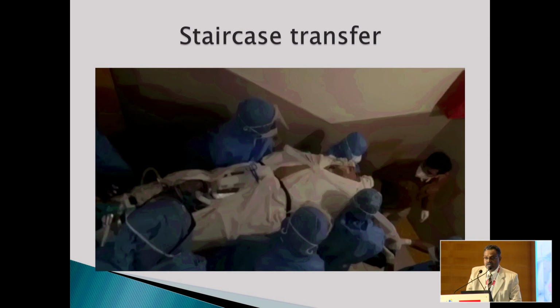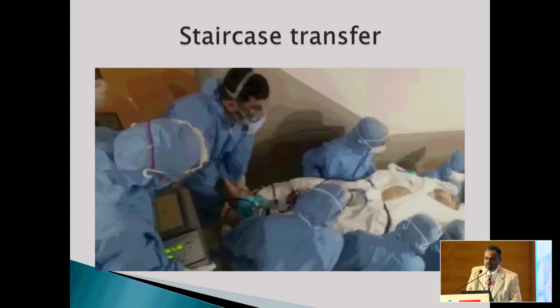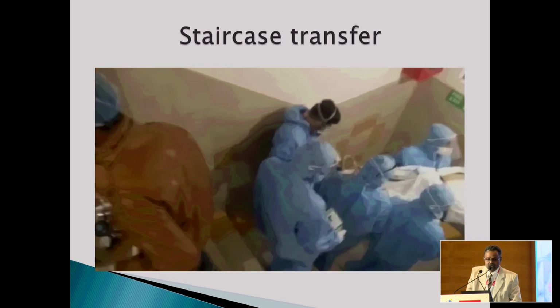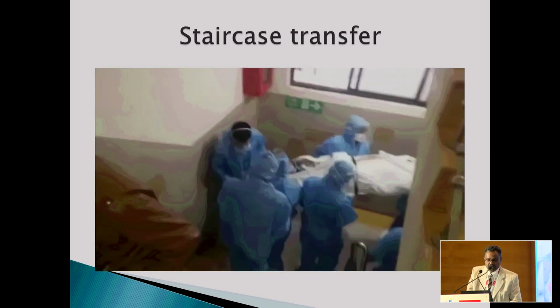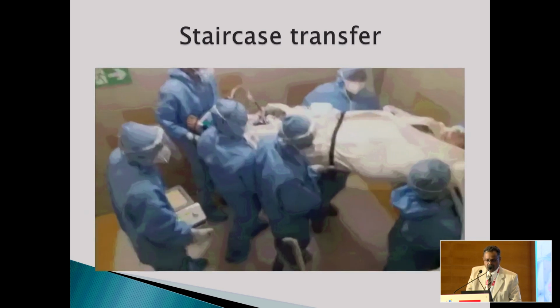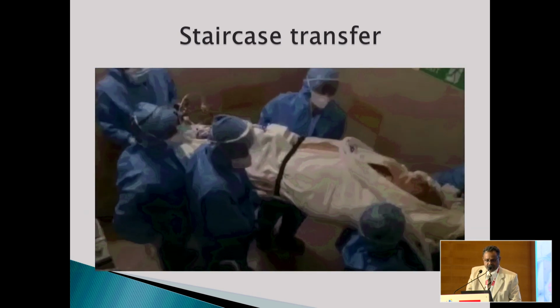Sometimes the hospital from which the patient is retrieved may not have a proper lift, so these kinds of patients have to be moved through the staircase. We moved a patient like that through the staircase during the COVID times, tough times. This is how a patient on ECMO was transferred, and that patient went home well.